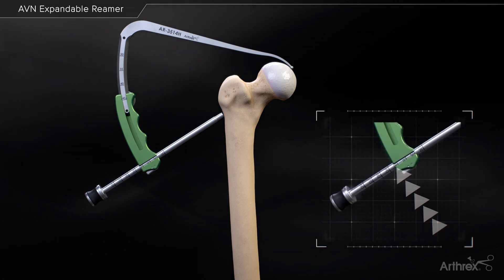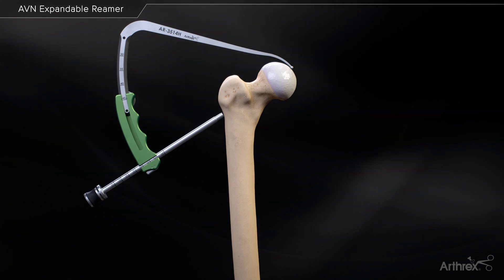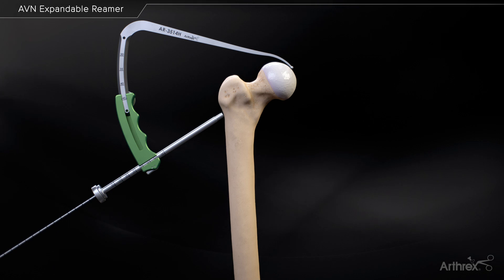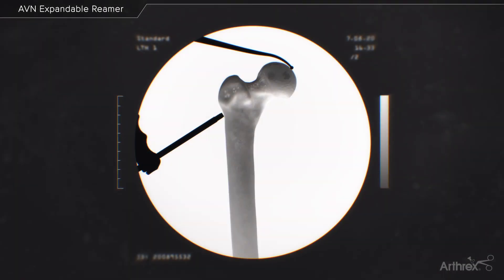Reference the intraosseous distance off the calibrated 5 mm drill guide sleeve. Remove the blunt obturator and insert the 2.4 mm drill sleeve. Insert the 2.4 mm calibrated guide pin through the arthroscopic drill guide under fluoroscopic view. Drill to the desired depth.